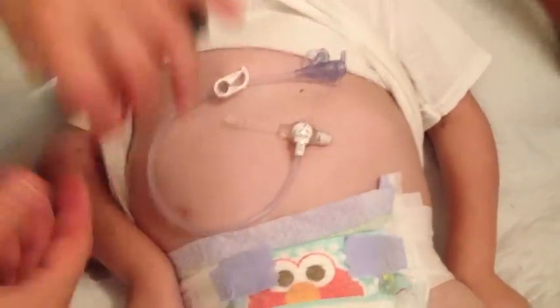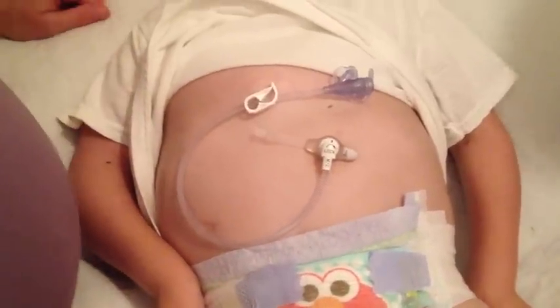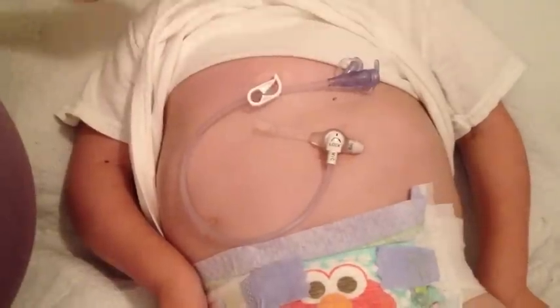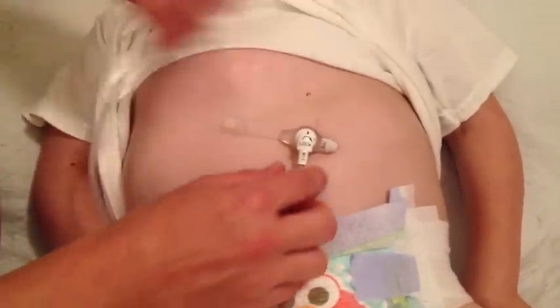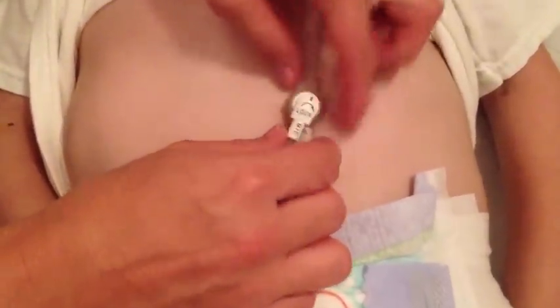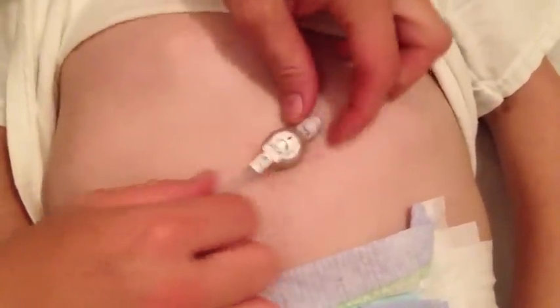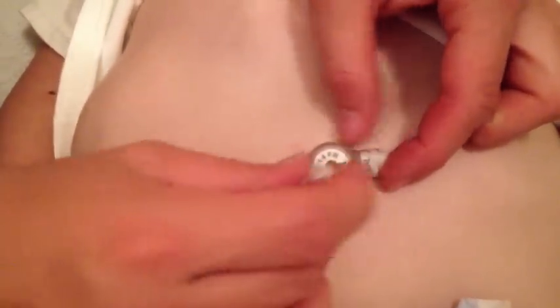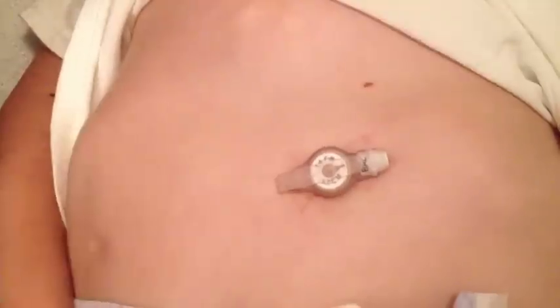For bedtime, that would be set and ready to go. You would leave his tube in for his meds or for his dinner. We're going to show how to take out the tube — basically you turn it in the opposite direction of the arrow, line up the two black lines, and it'll just pull right out. Then put the clamp back in, make sure it snaps in, and he's ready to go.